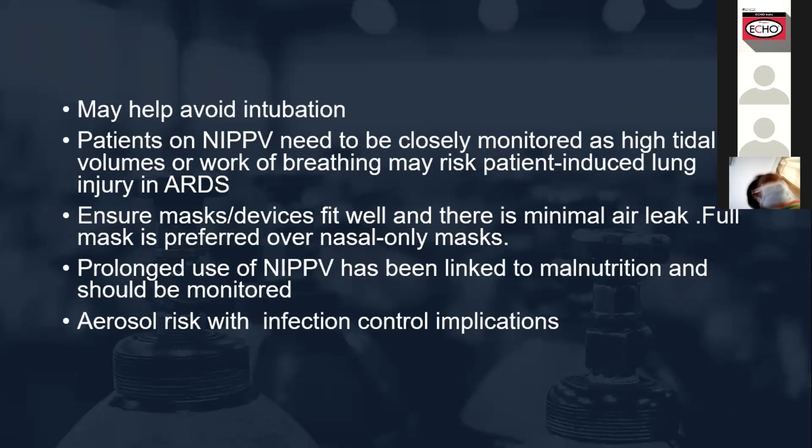So this non-invasive positive pressure ventilation can help you avoid intubation. If you are in a center where having a ventilator machine is a problem, you can rely on this.